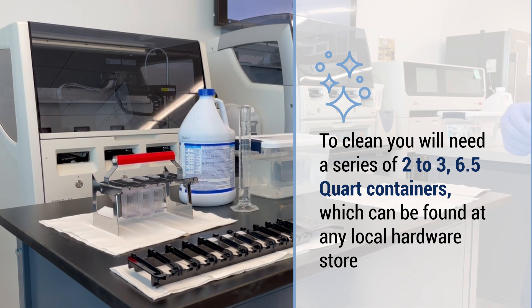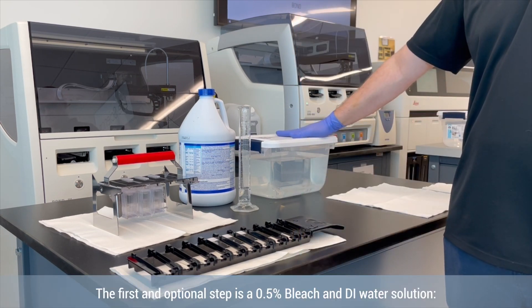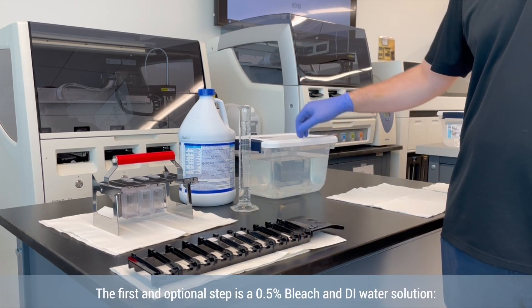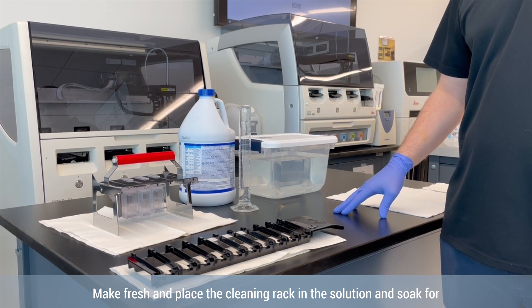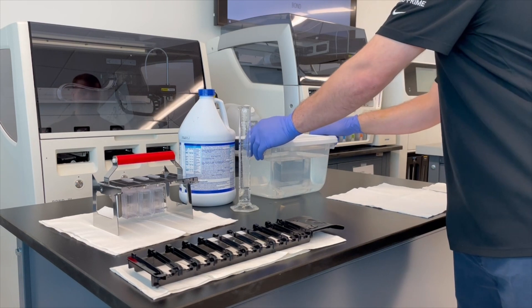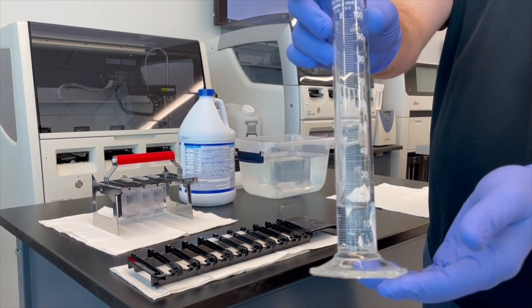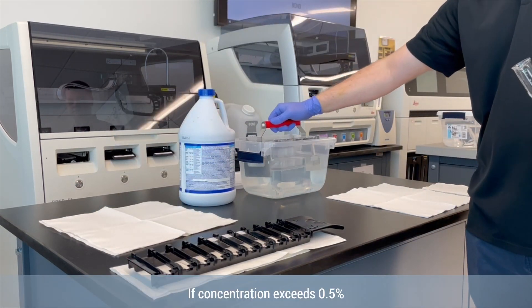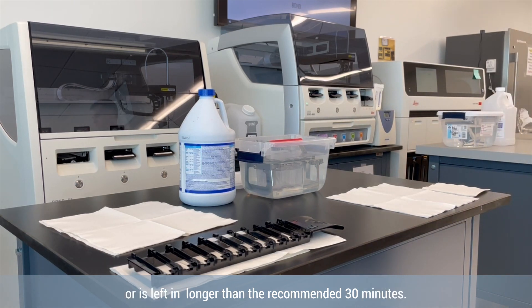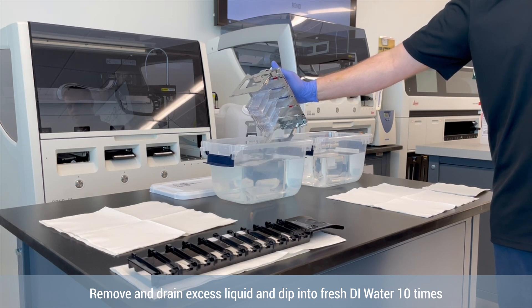To clean, you will need a series of two to three 6.5 quart containers, which can be found at any local hardware store. The first and optional step is a 0.5% bleach and DI water solution to remove any DAB residue. Make fresh and place the cleaning rack in the solution and soak for 30 minutes. If the concentration exceeds 0.5% or is left in longer than the recommended 30 minutes, it can have a negative impact on the cover tile. Remove and drain excess liquid and dip into fresh DI water 10 times.